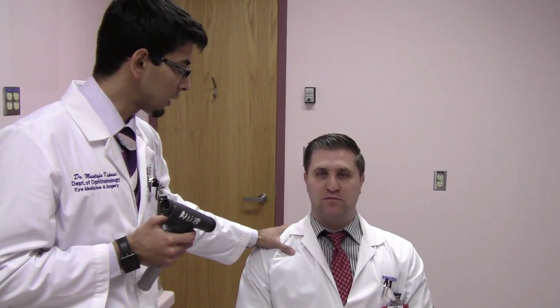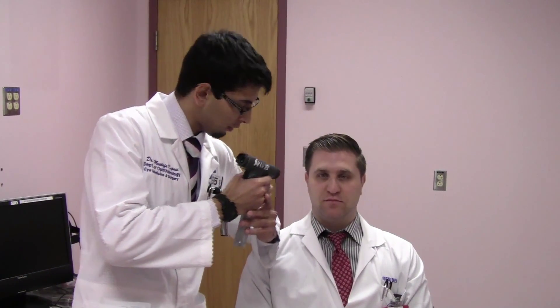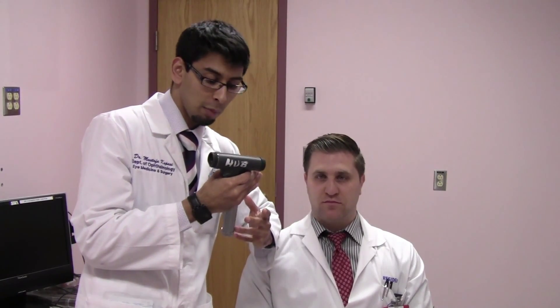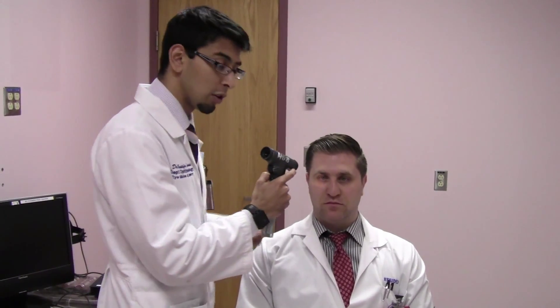We always start by examining the right eye. Get the patient to look into the distance far away. Approach the patient by stabilizing yourself first — put your arm on the patient or hold the chair, keeping your elbow on the patient and using two hands to support the ophthalmoscope. An advantage of the panoptic is you can use your right eye or left eye to examine either eye of the patient. Approach at 15 degrees — the first thing that will come into view is the red reflex, followed by the optic nerve, which is 15 degrees off axis.